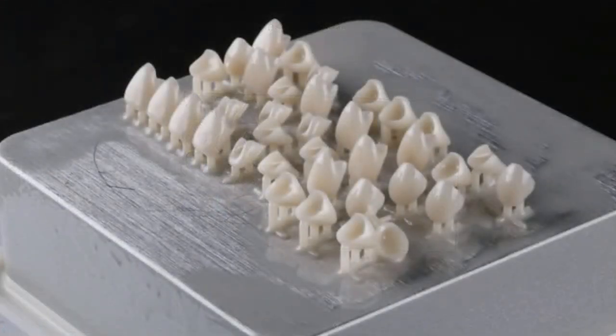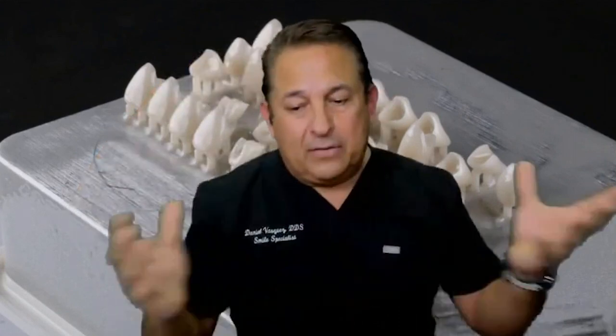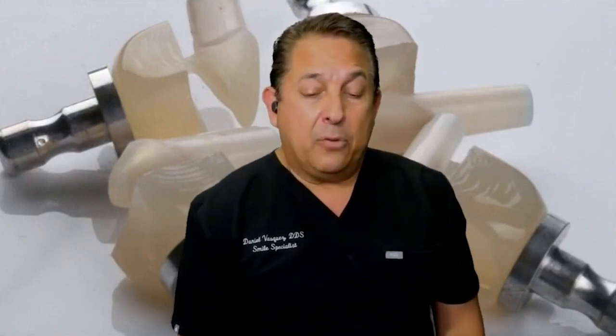Just wasting some resin. And I want to see how long it's going to take to print these restorations. So literally, if you print about 40 of these and you print one, it's going to take the same time, because printing is not about the amount, it's about the height. So if it's higher, it's going to take more. If they all have the same height, it's going to take the same time. There you go. We did mill these restorations for my cases.